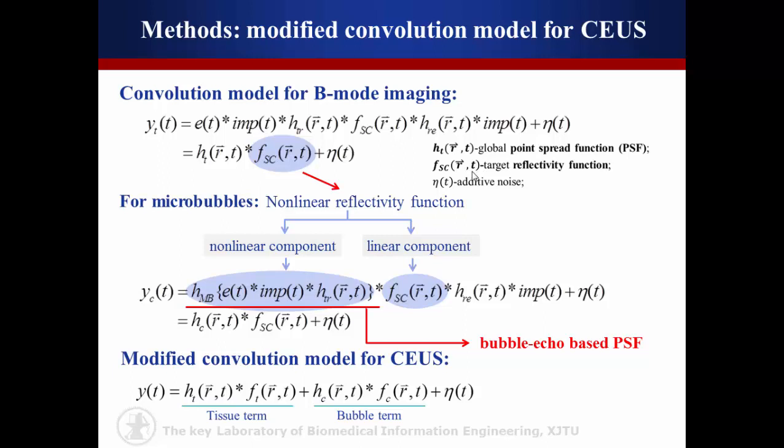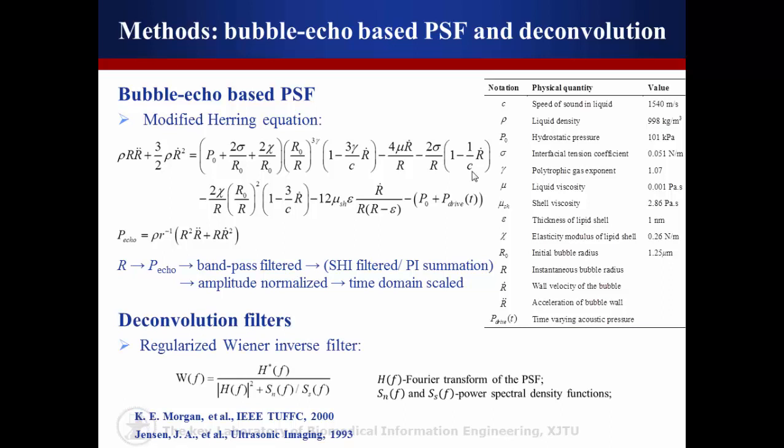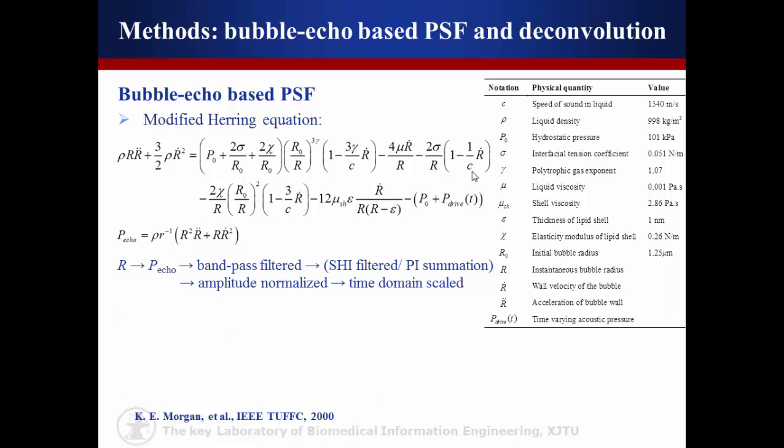Considering the nonlinear response of microbubbles, a bubble echo-based PSF was proposed in our work. In bubble echo-based PSF, bubble echo was firstly constructed from the modified Herring equation. All the parameters are listed in the right table, and the values are set suitable for SonoVue.